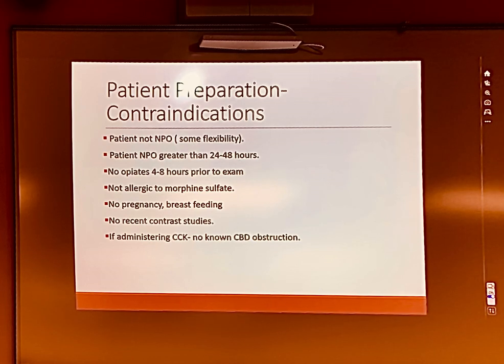So what are the contraindications for a study like this? Your patient comes in and they got McDonald's on the way, they're canceled. They ate, they're done. If they've been fasting longer than 24 to 48 hours, that's a question for your radiologist. What do you want me to do?